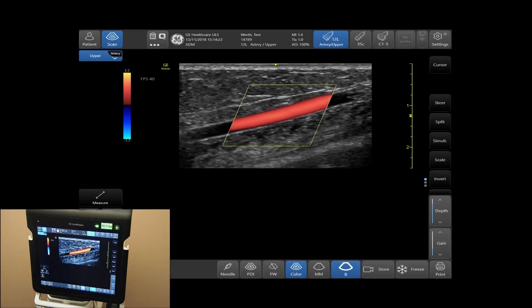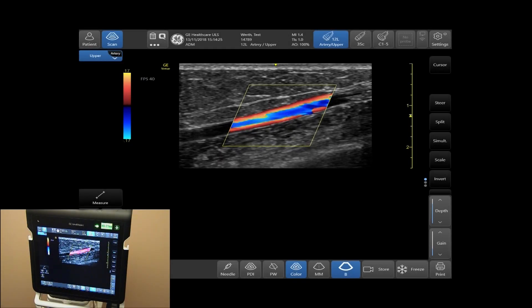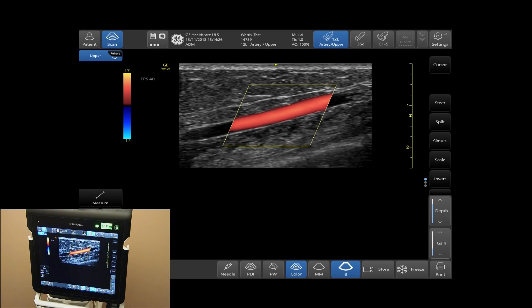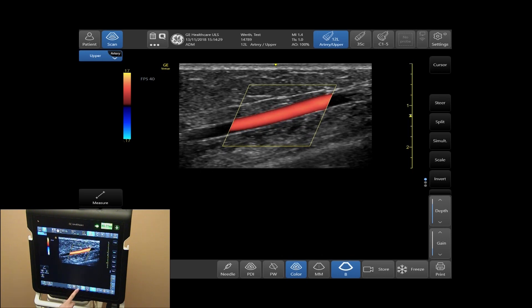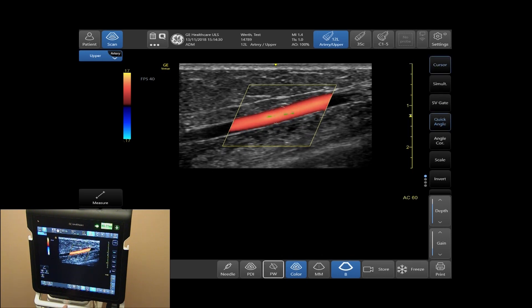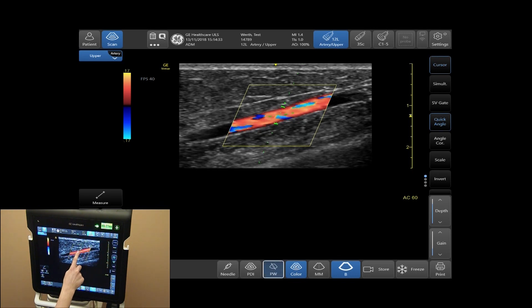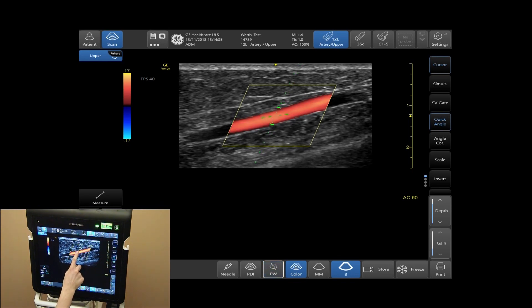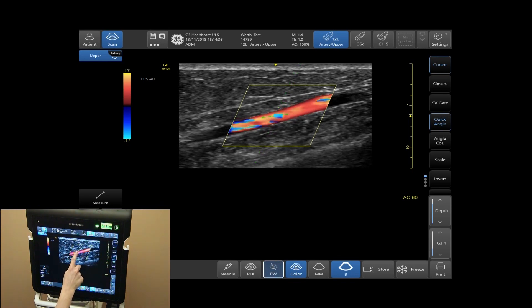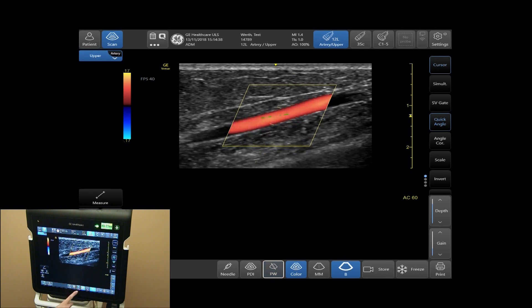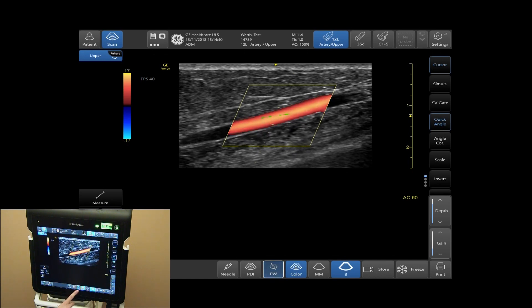Optimizing your Pulse Wave Doppler. To activate your Pulse Wave Doppler, tap on PW on the bottom of your screen. Tap and drag your sample volume gate into position of the vessel. Tap Pulse Wave once again to update your spectral Doppler.